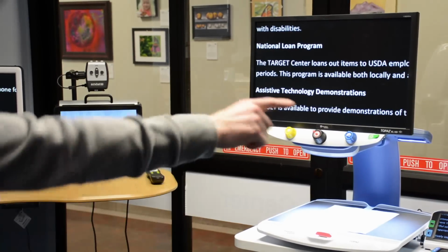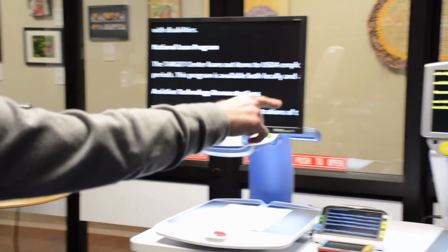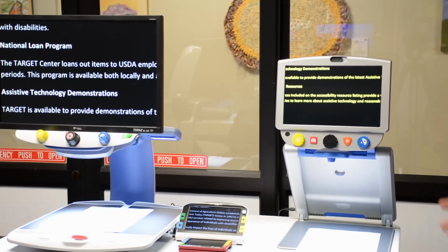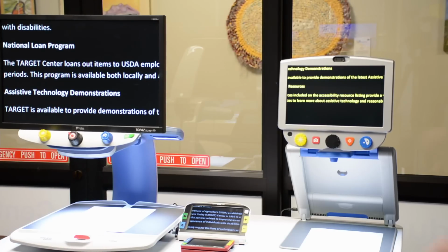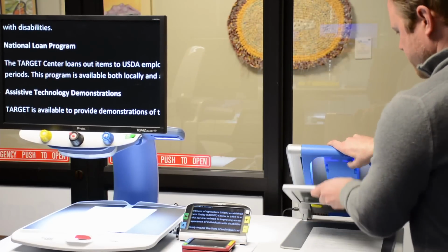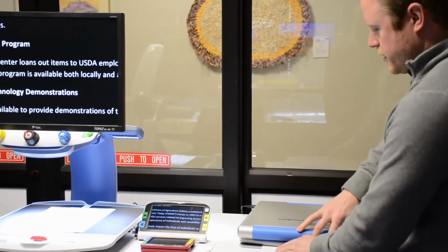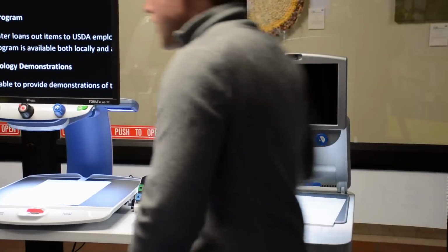And when we take a look at the outside here, you have ones that are a little bit smaller. This one right here is a 13-inch screen. We have a Topaz magnifier here. This is a 12-inch screen. Both of these are items that you can get with travel bags or even use your own travel bag. So this could be something that you take around the building with you or take to a conference, whereas those are always going to probably stay put. You can grab something like this and they just fold up and you put this in a shoulder bag, and they have batteries in them so they can last a few hours without even being plugged in. Same thing with this one.